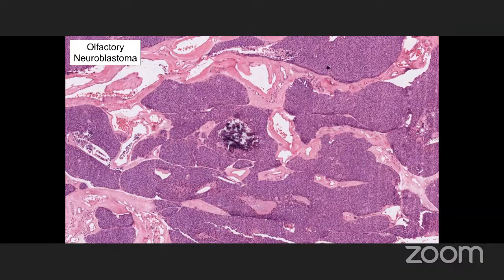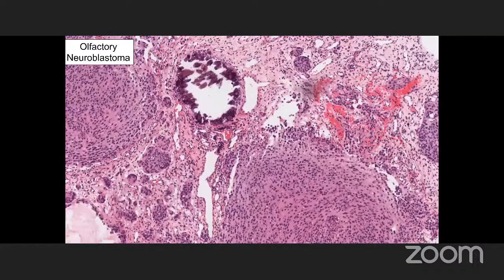Now, histologically, even though they're not carcinomas, they are some of the most tightly nested tumors you will ever see in their well-differentiated forms and their lower grade forms. And this is a good example of that, where you can see these very tightly nested large collections of cells. The nuclei are pretty round and monotonous. Dystrophic calcification is another clue that olfactory neuroblastoma likes to get.